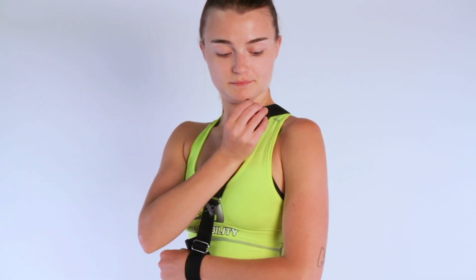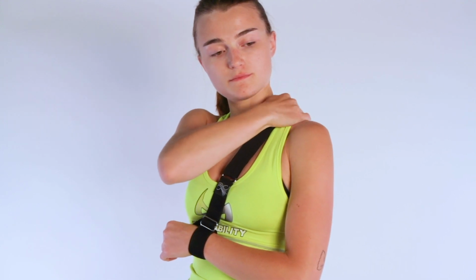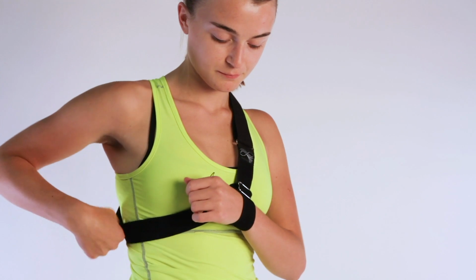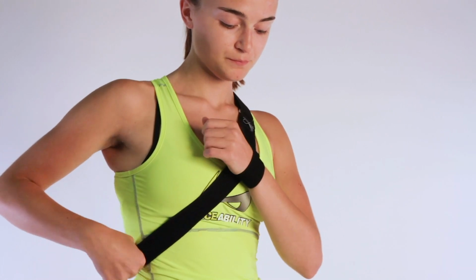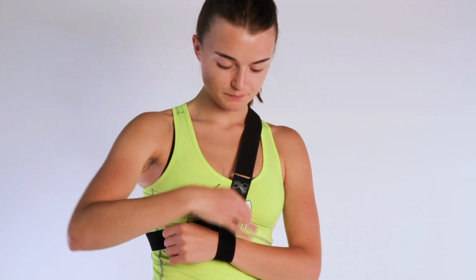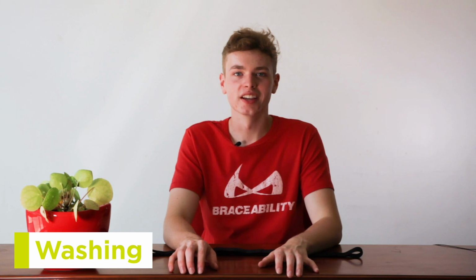Adjust the fastener on the shoulder strap to change the degree to which it holds your arm up. The tighter that you have the strap, the higher up it will hold your arm. If you need your hand and arm to be elevated, you can rotate the shoulder strap around your body to bring them higher up on your torso. Once it is applied, you can continue to adjust the shoulder strap and the wrist strap to your desired fit. Cleaning this sling is also quick and easy. Hand wash it in warm water with mild detergent and allow it to air dry completely before reapplying.